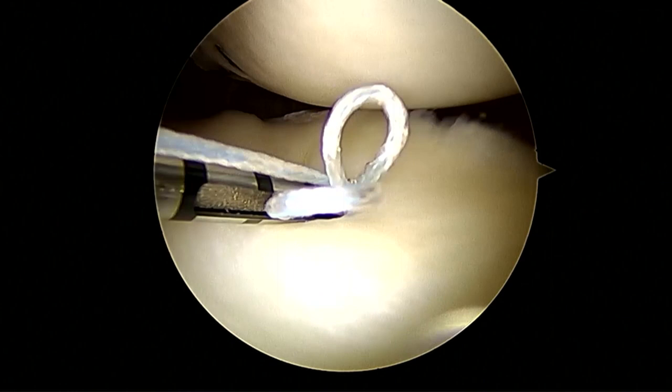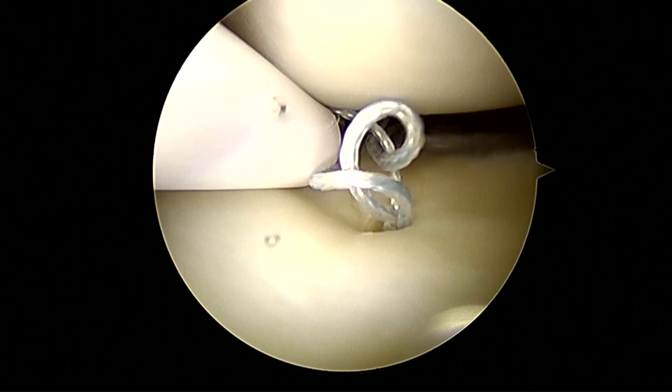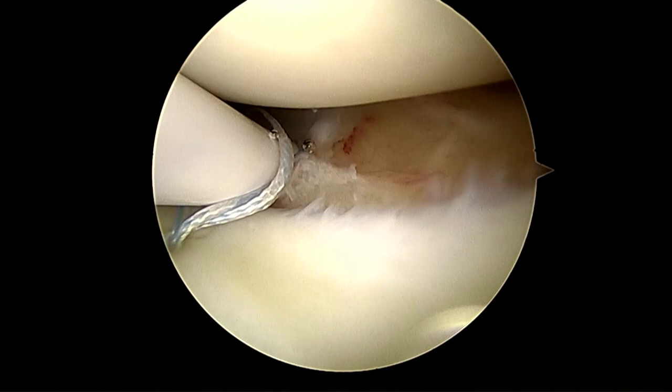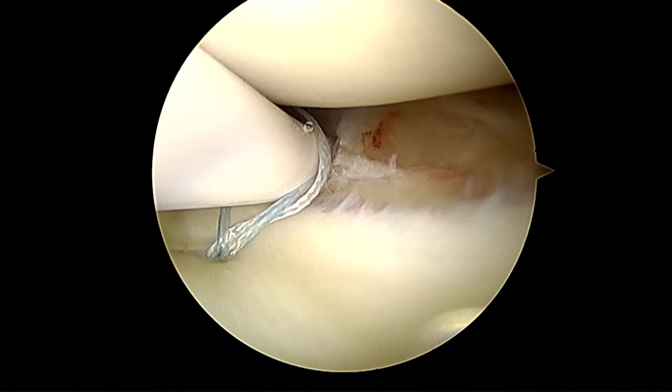And a vertical mattress suture has better pull-out strength. We avoid taking a horizontal mattress suture, but sometimes there is a cost constraint, so we take a horizontal mattress also. And now it is going to the periphery, the peripheral part of the meniscus, so that we get good compression at the tear site with the vertical mattress type of configuration.